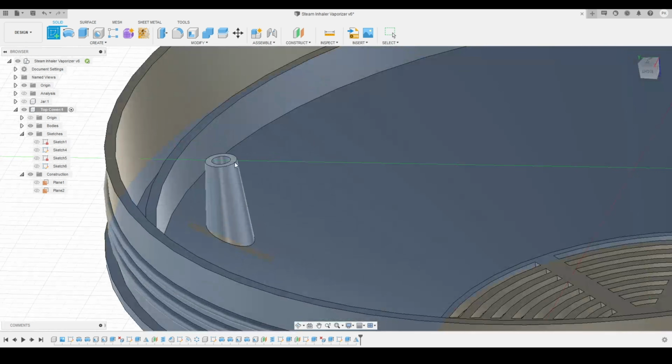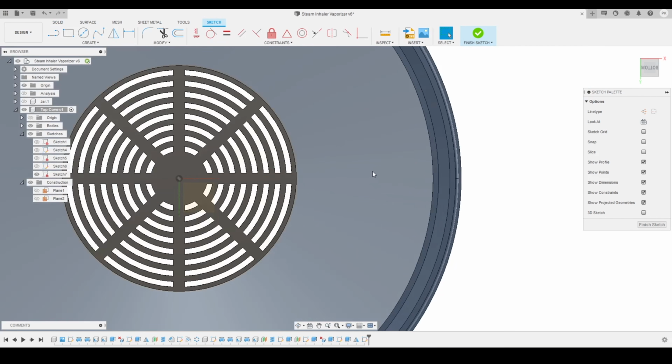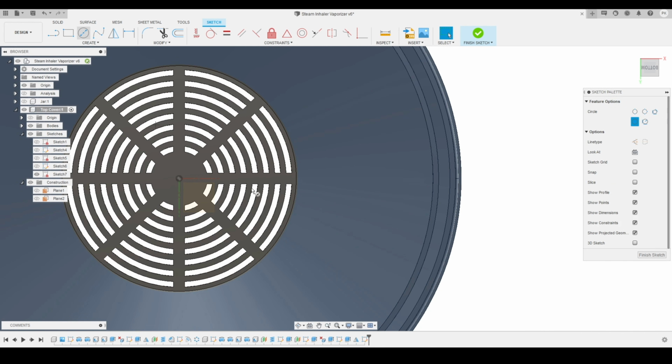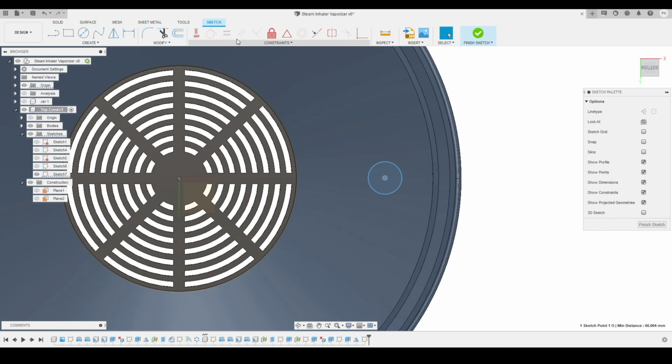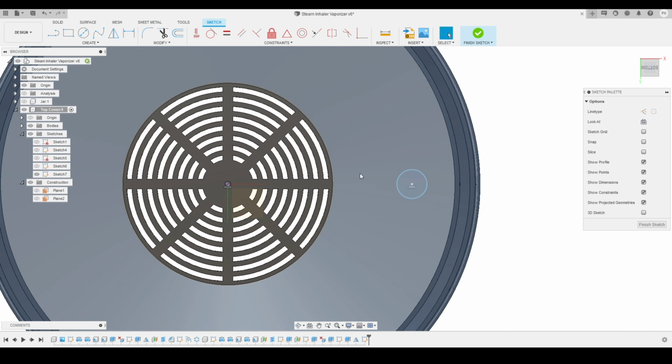I will activate the create sketch tool. We'll select the top of this feature as a sketch plane. Here you can see my tools are active now. My sketch planes are also active now. So now I'm going to create a circle over here like this. I will make sure that these two points are on the same horizontal position. So I had applied the constraint between these two origins, and here you can see this is the circle that we had created.